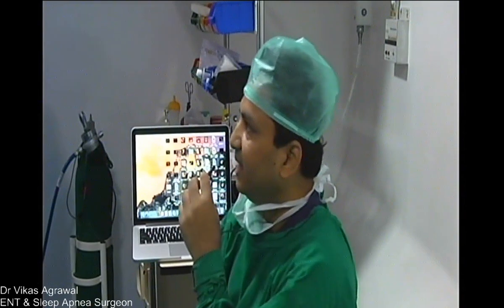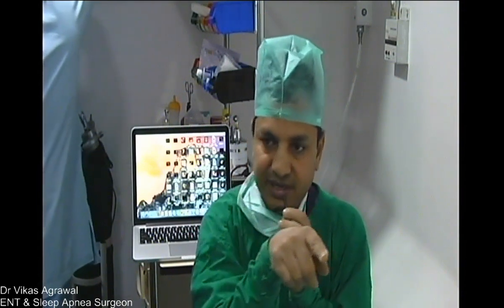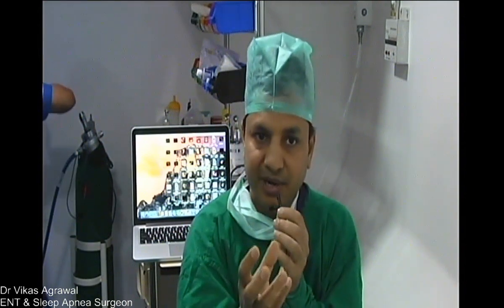Second thing is that, as I explained the concept, the turbinates are like this. If you see, this is the turbinate on my left side, it is like this, and the turbinate blade is straight. So if you out-fracture, then you can still use the turbinator, but the turbinator works on the medial surface of the bone. The middle part of the medial surface of the inferior turbinate is not very bulky. Posterior part is only polypoidal.